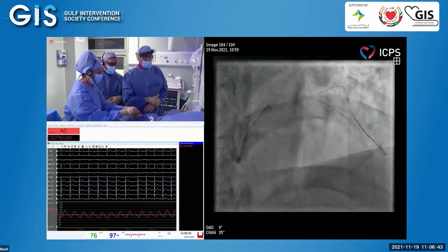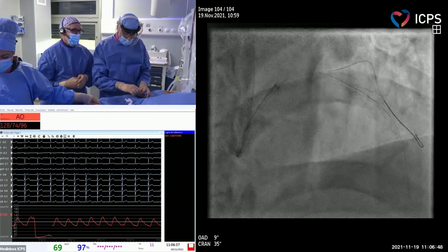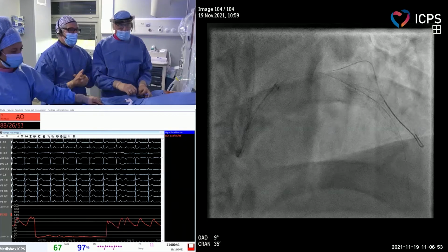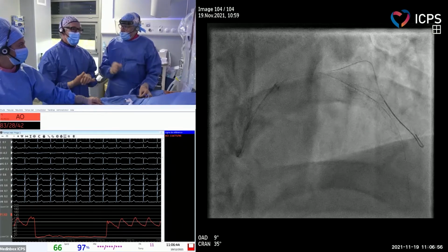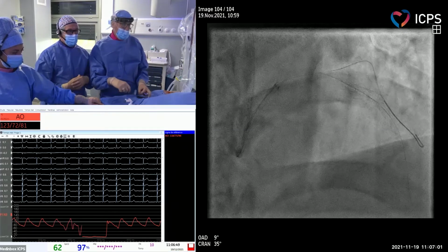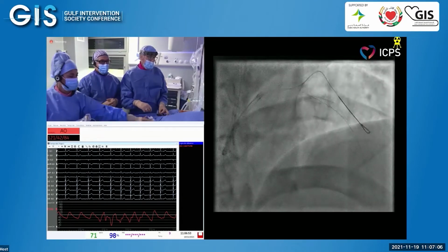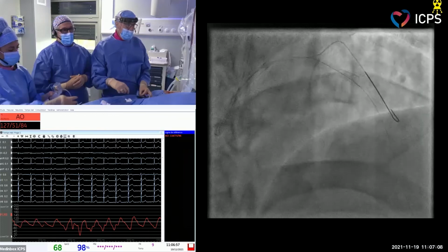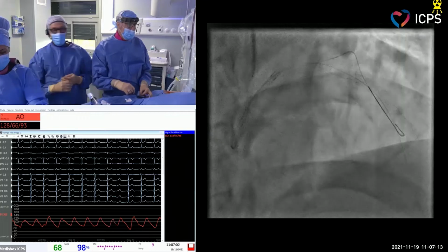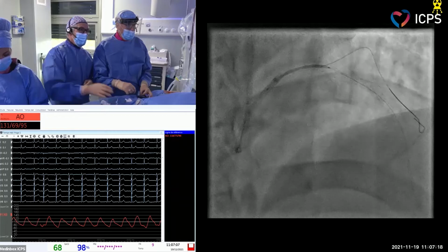So you're going to go inside the previous stent? I think we will just be edge to edge, I think. Maybe there will be an overlapping of 2 or 3 millimeters. Yeah, we will see, but 28, I think, is a good length. Are you planning to go back to the ostium of the left main in this case? Yeah, that's a very interesting question. I think we have the feeling that the ostium is okay, and it was the case by OFDI also. So we don't need to be up to the ostium.